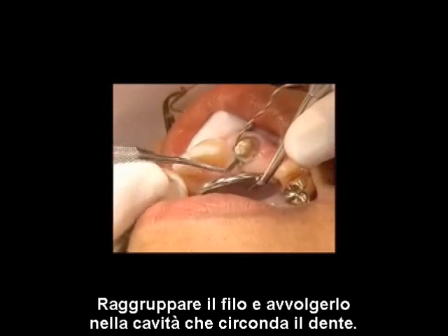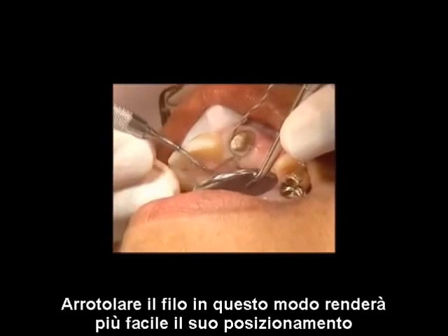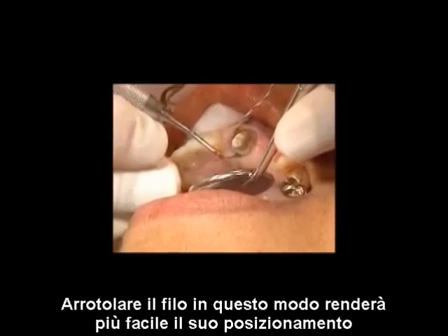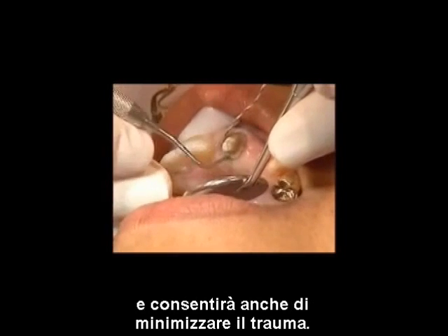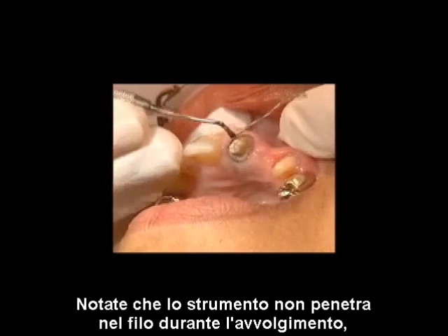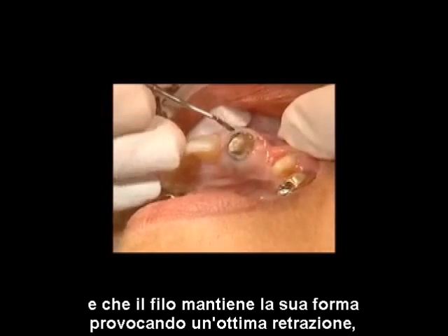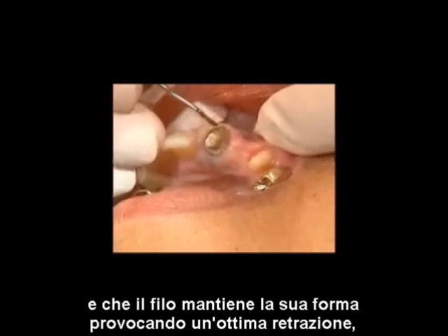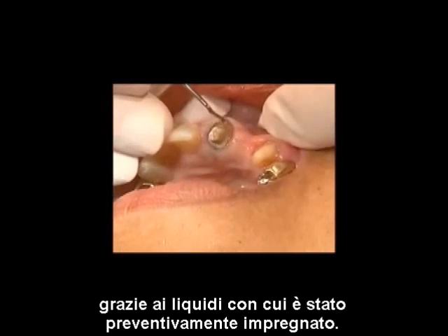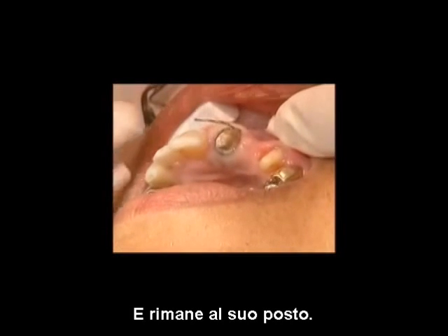Pack the cord, rotating it into the sulcus against the tooth. Rolling the cord in this manner not only makes it easier to place, but also minimizes trauma. Note that the instrument does not penetrate the braided cord during packing, and that the cord retains its shape, providing optimal retraction. Because the cord has been pre-moistened and easily absorbed sulcular fluid, it softens and stays in place.